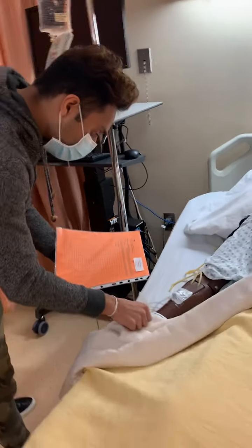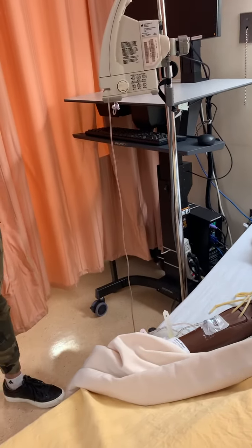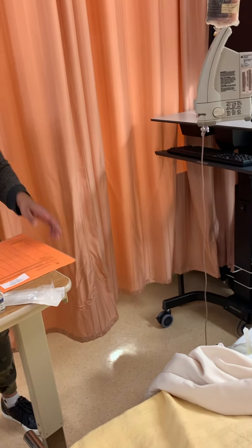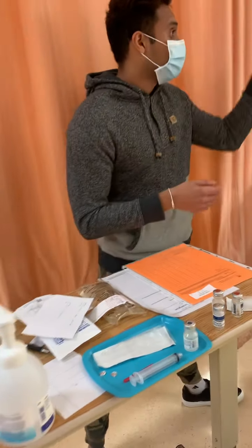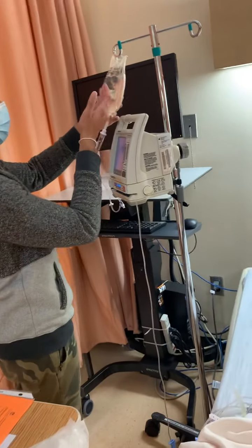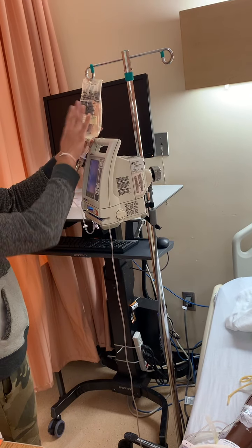And we already washed our hands before we touched the patient. So we're checking the armband, it's all good. Allergic to shellfish, okay. Can I get you to state your name and date of birth? Okay, and do you have any allergies? Allergic to shellfish, okay, that's what it says here. Okay, now we're going to look at the IV site. We see that the last nurse has labeled it here, so we know it's not expired, with their time, date, initials, and their name. And we see it's normal saline, they're both compatible with each other, so that's good.